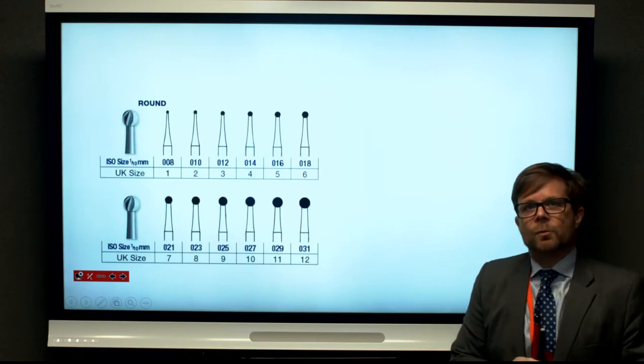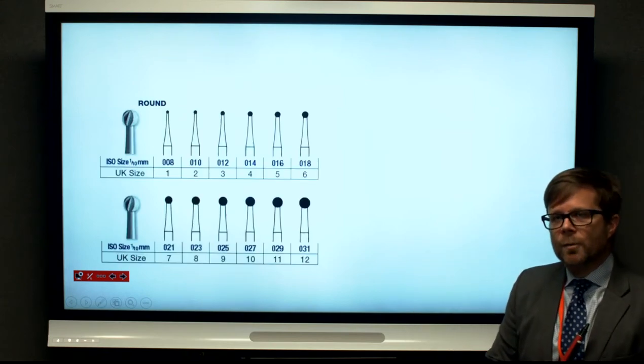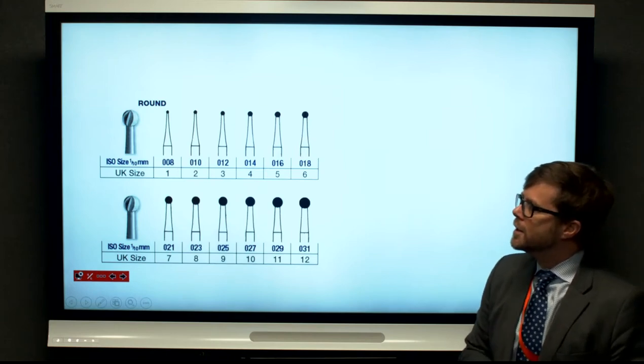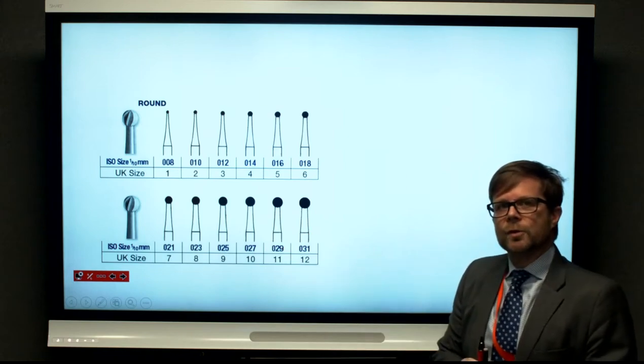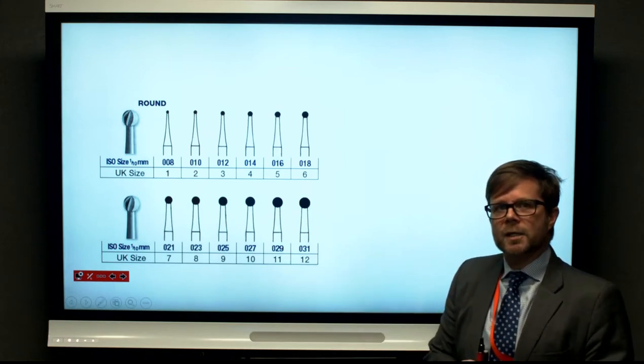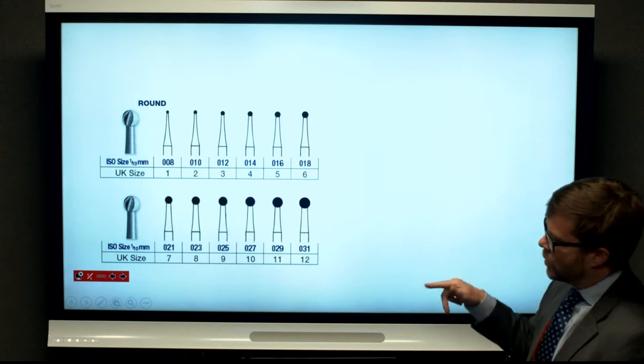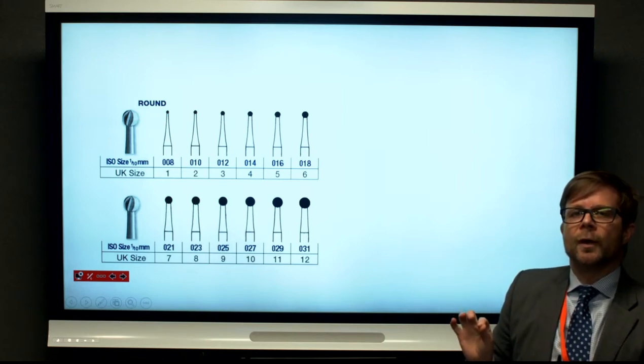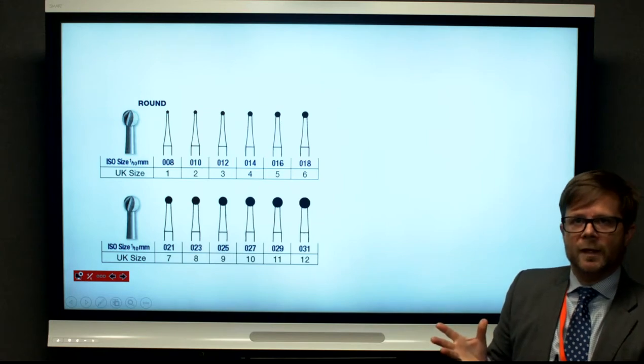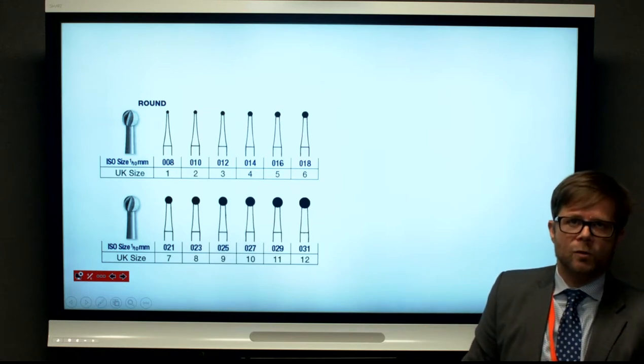The burrs that we will be using for caries removal in the simulation exercises will be round burrs. There's a number of different size burrs that you may want to select. The general rule is choose the largest burr that will fit the area of dentine that you want to remove.